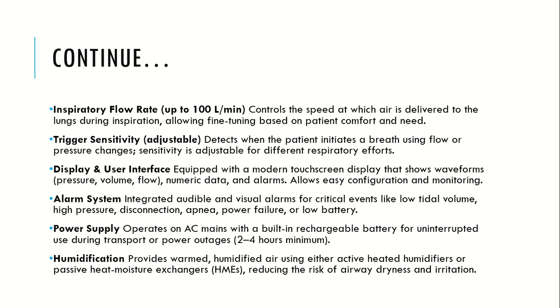So the power supply mainly operates on AC with a built-in battery that works in emergencies like an outage of power, that works for a minimum of 2 to 4 hours, and if the monitor's brightness is low or somebody made it low, it will work for more time. The humidification provides warm humidified air using either active heated humidifiers or passive heat moisture exchangers, reducing the risk of airway dryness and irritation, so the patient doesn't get irritation in the trachea and the airway does not dry.